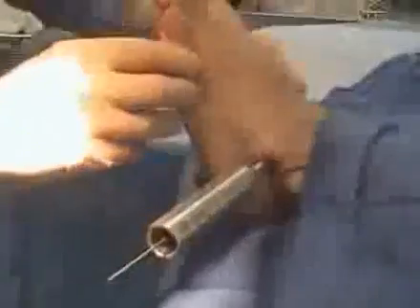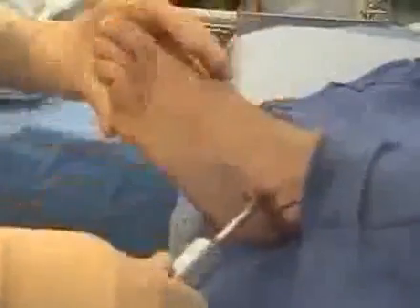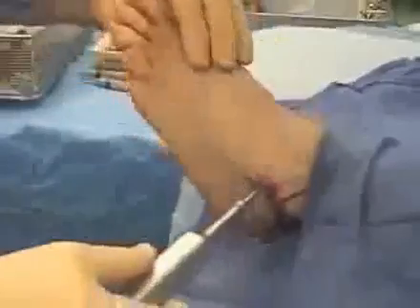Now we go to our trial sizer. Here's the number 6 trial sizer, and you want to again look at your angle. You should not be able to over-insert this. Push it in and then load the fourth and fifth met heads. You'll instantly see the kind of correction that you're going to achieve with the stent.